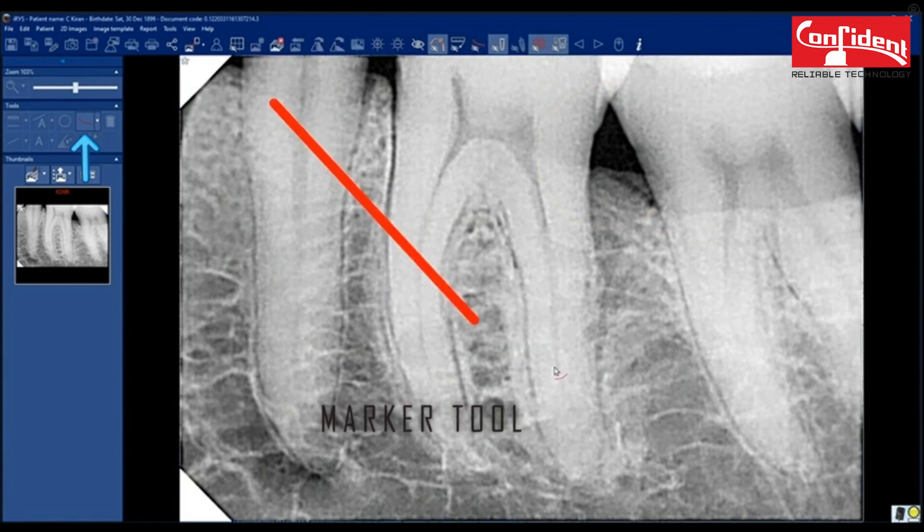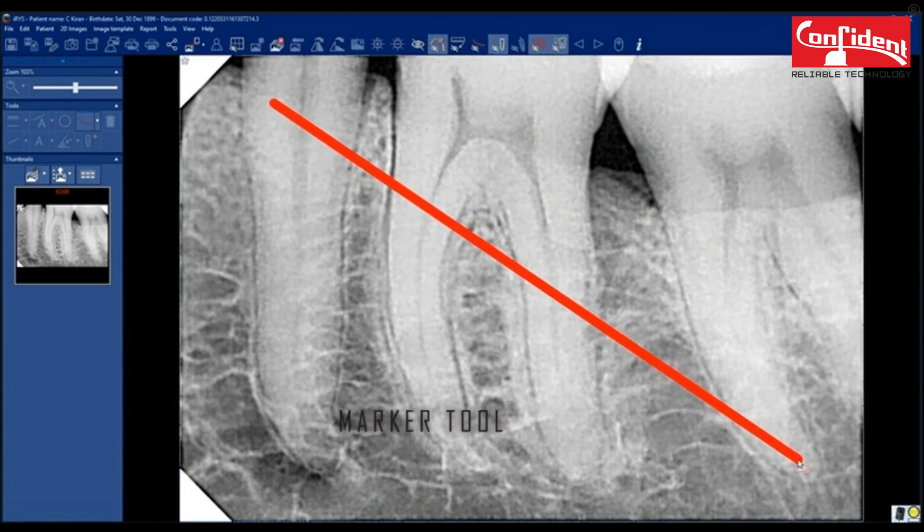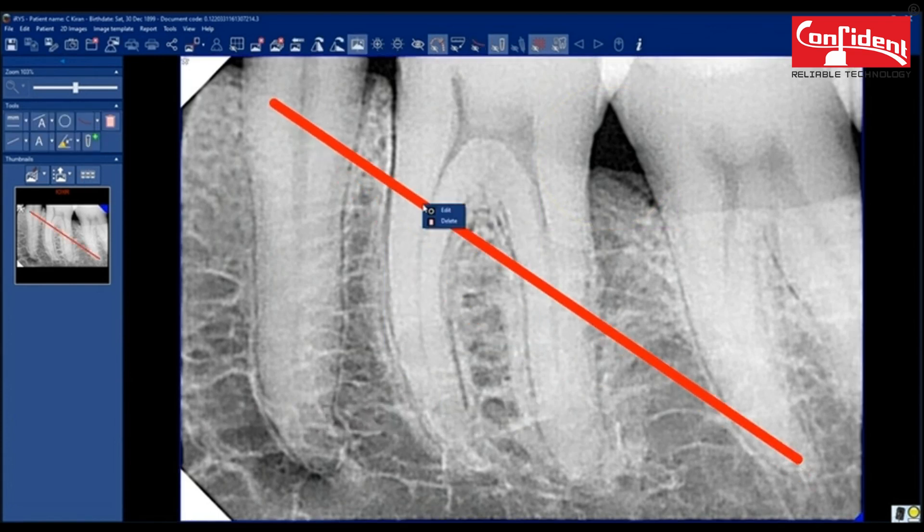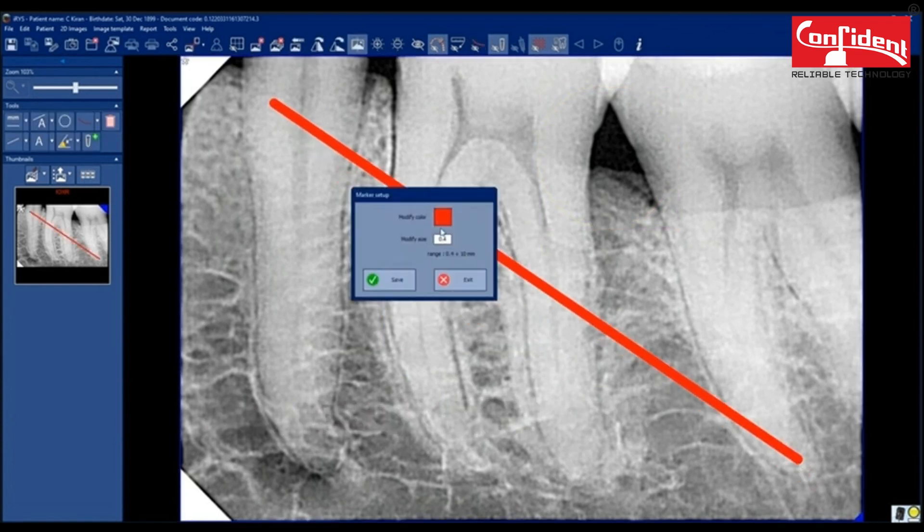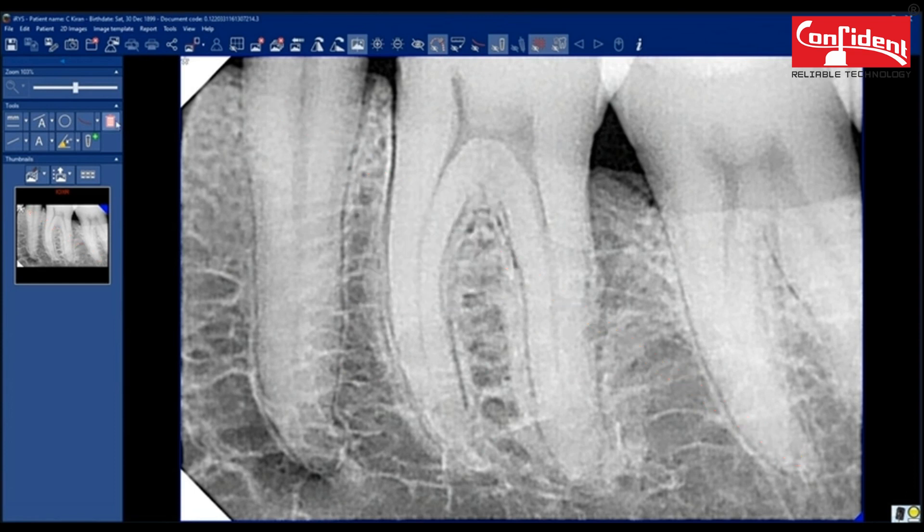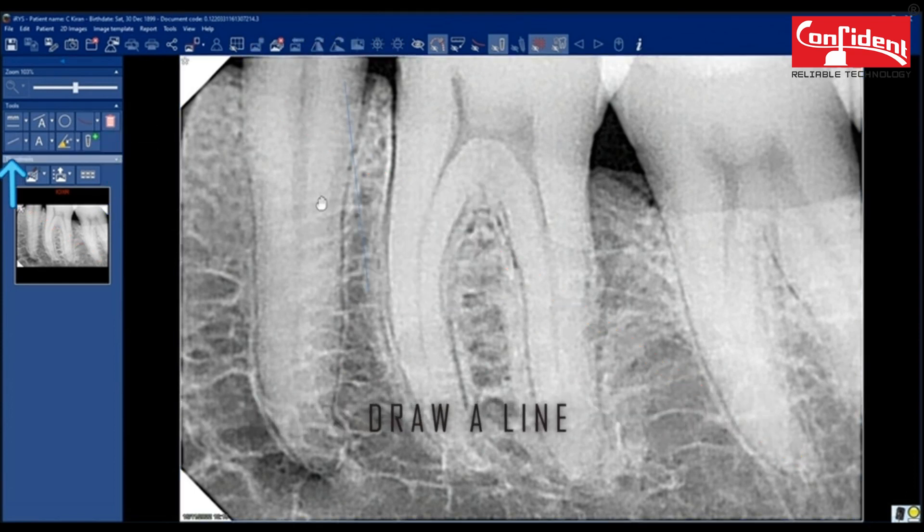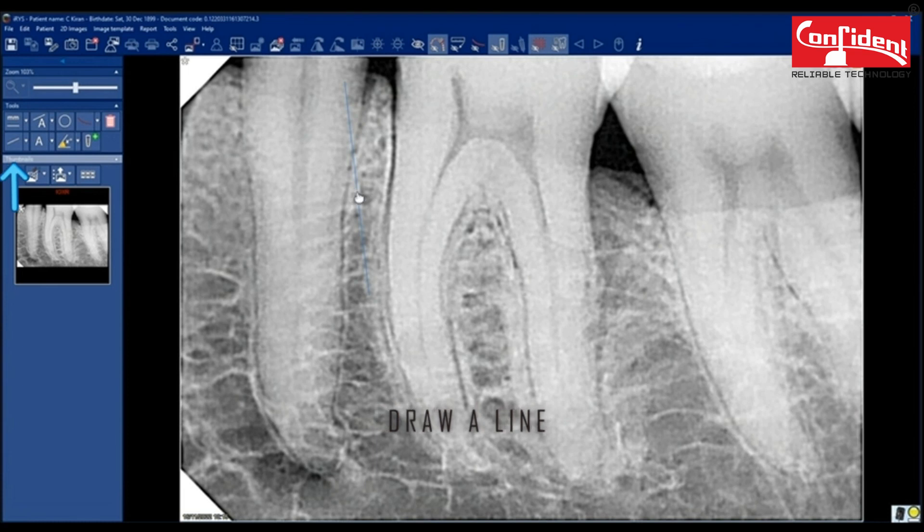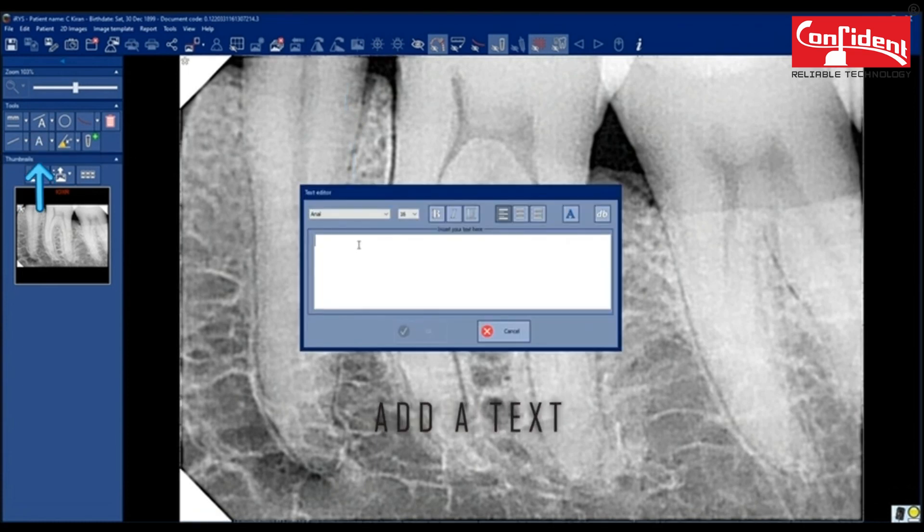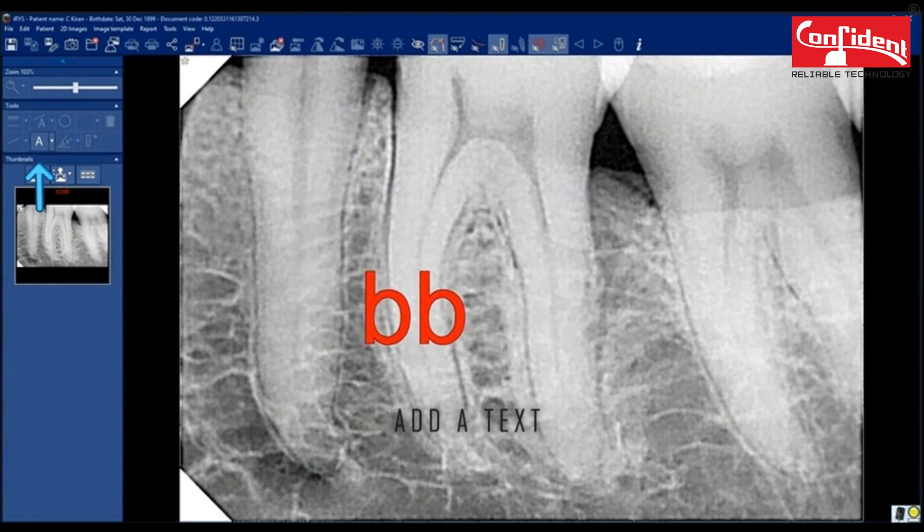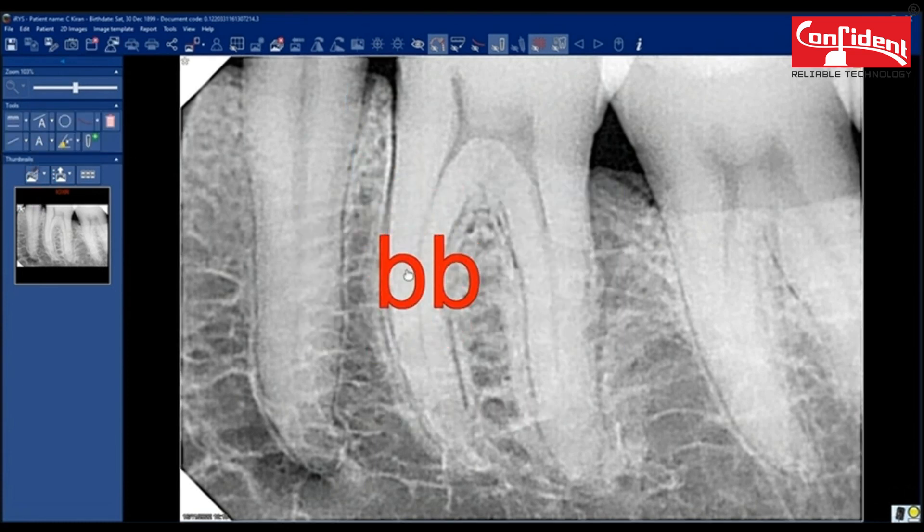Use a marker tool to mark anywhere in the image. Edit the color and thickness of the marker. Delete all the selected changes. Draw a line using this tool. Add a text and place it anywhere in the image.